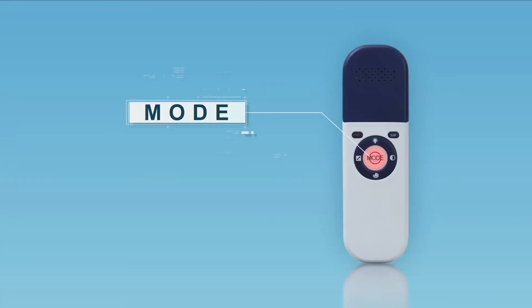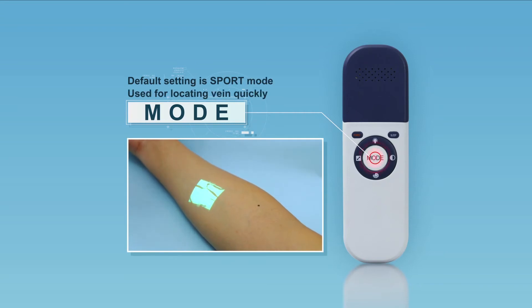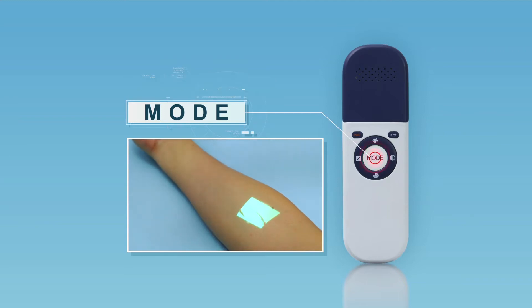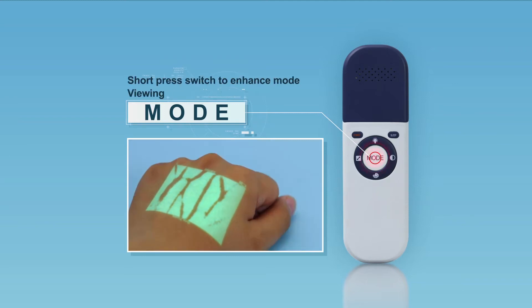Two display modes are available: Sport and Enhance. The default setting is Sport mode for locating veins quickly. Short-pressing the Mode button switches to Enhance mode, which is used for viewing finer details of smaller and deeper veins — especially useful for pediatric, overweight, and edema patients.